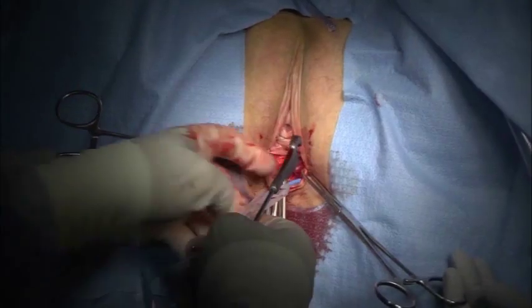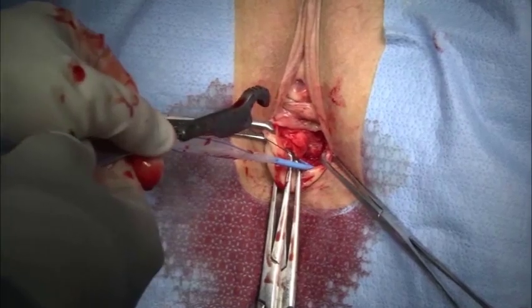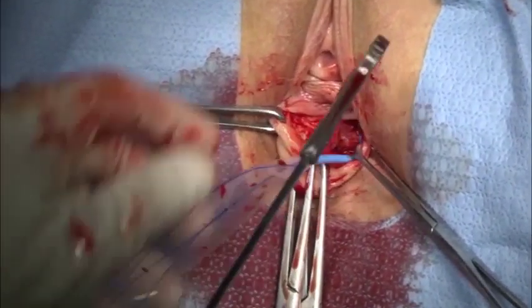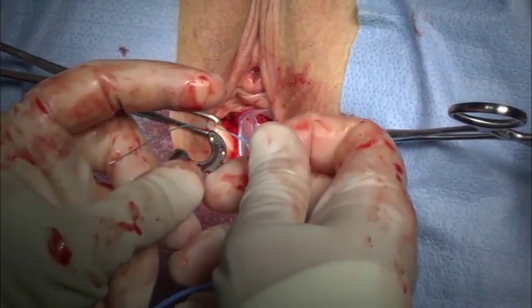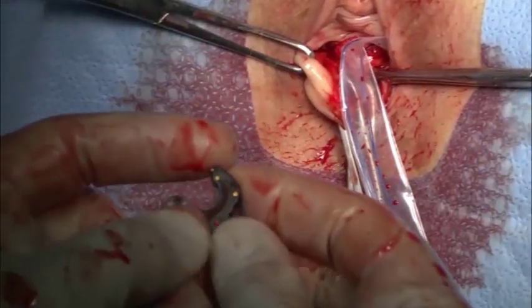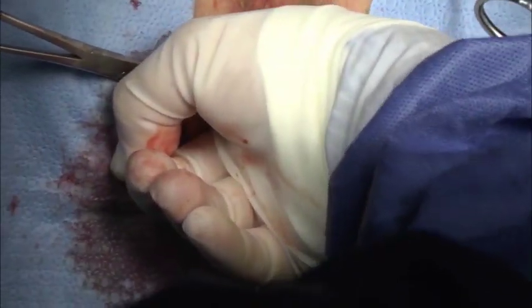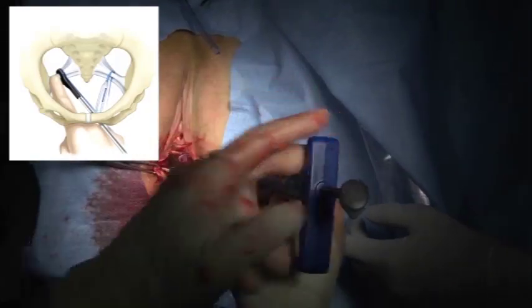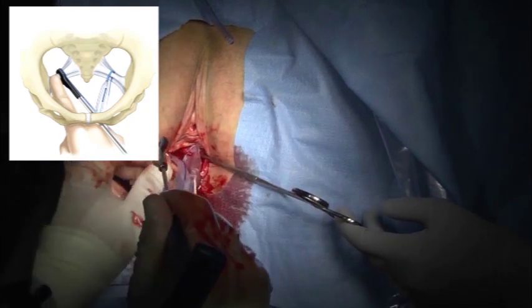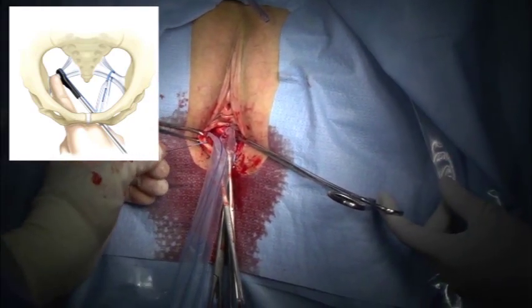Once the mesh leg leader can be grasped, disconnect it from the capio device and confirm positioning on the sacrospinous ligament. We now repeat the process on the patient's right side. Now both legs are in place. Remember that keeping the sleeve intact may facilitate device repositioning in the occasional case where the pass is not optimal.